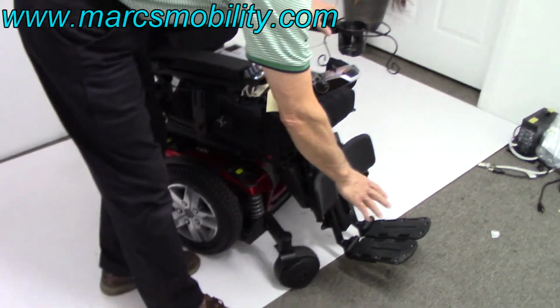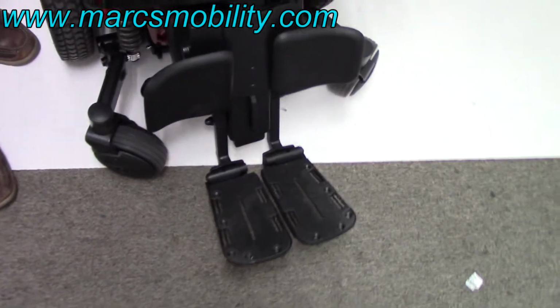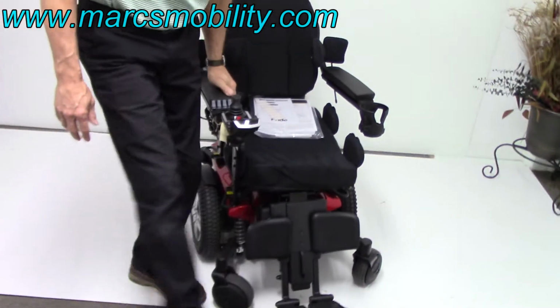These are a little bit smaller foot plate. These are probably the 9-inch foot plates. That's all you need, really. You don't need the longer ones because most of your foot will fit on there with no problem anyway.